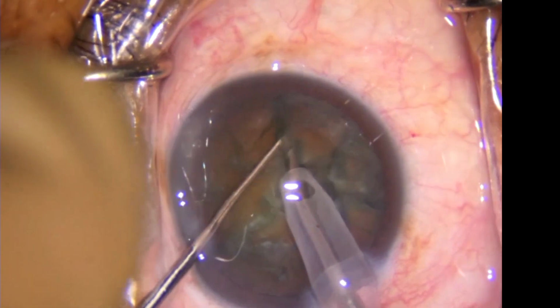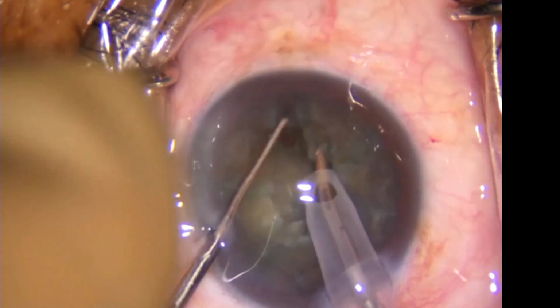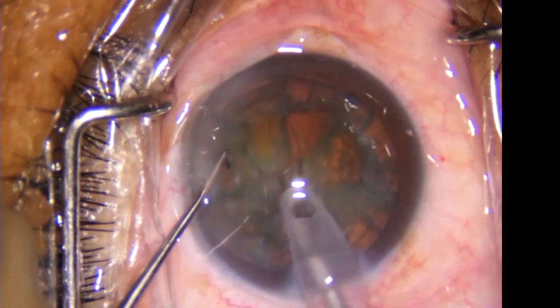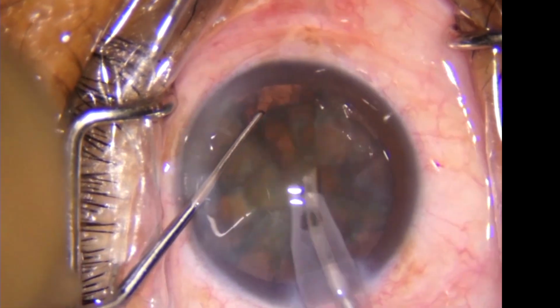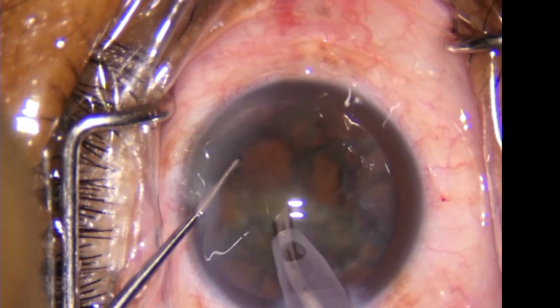You can, in very soft cataracts, not even go into the nucleus. You can just support. Here I'm going in, holding with vacuum, staying on. I will have 5 minutes for the hydrodissection part. Even if I don't touch hydrodissection, I'll use 5 minutes more. So now once they have all separated, the emulsification part is the same. Hold them, bring it to the center, emulsify.